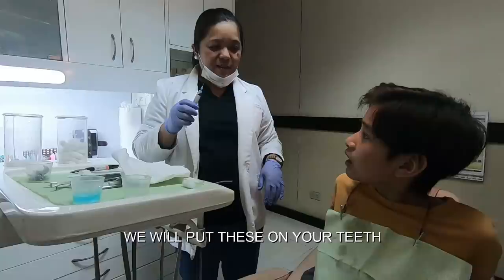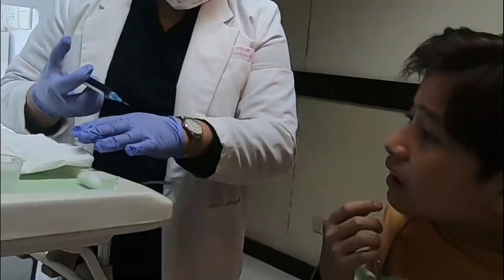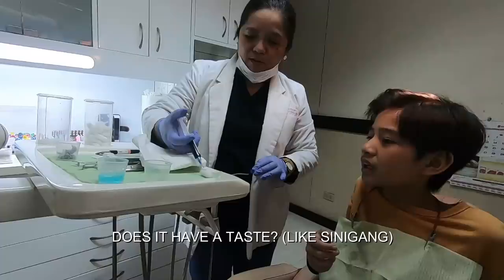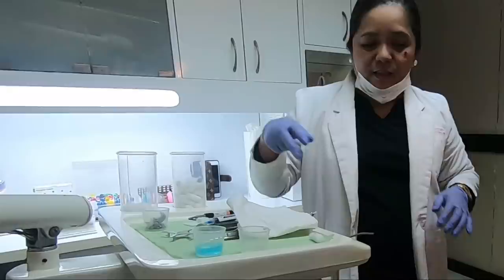We will put this on the teeth — just carrying the material and placing it onto your teeth like that. Like that, you have the teeth. But we have water in the mouth, so I have to segregate it.